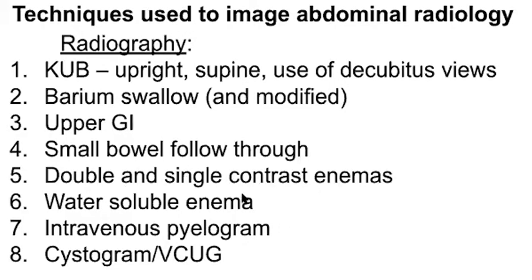Double contrast barium enema is when both contrast and air is insufflated into the rectum throughout the colon. The double contrast enema was done previously for screening colon cancer, but now either colonoscopy or CT colonography are indicated for colon cancer screening. Our next topic is water-soluble enema.